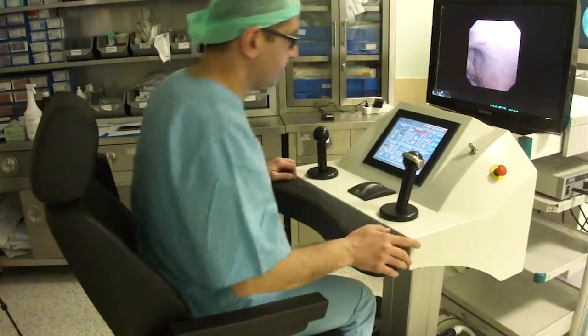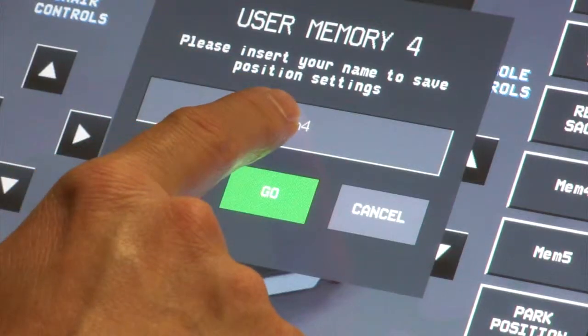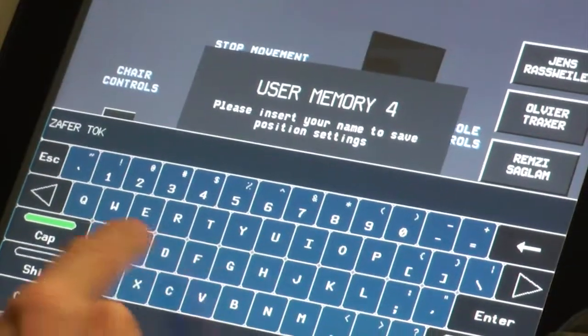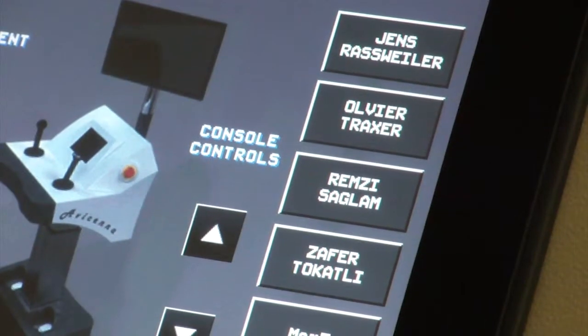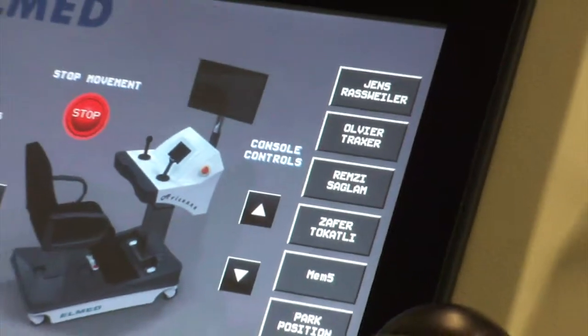The surgeon then sits at the console. The position of the ergonomic chair, armrest, and control panel can be individually adjusted and stored in the system for six users.